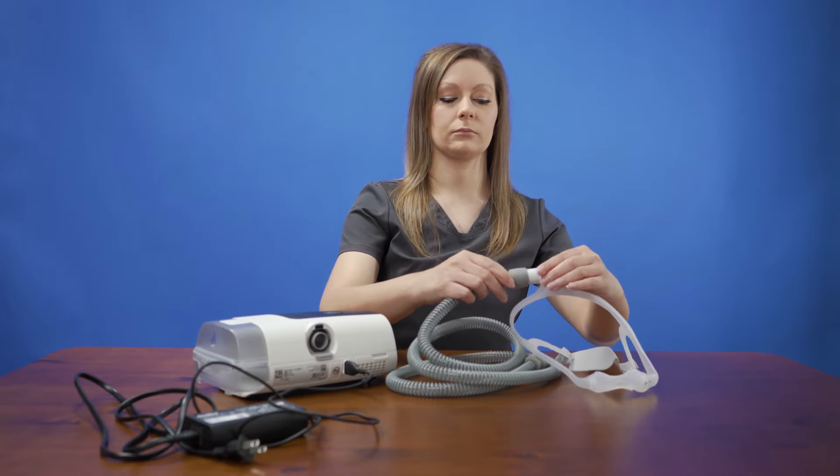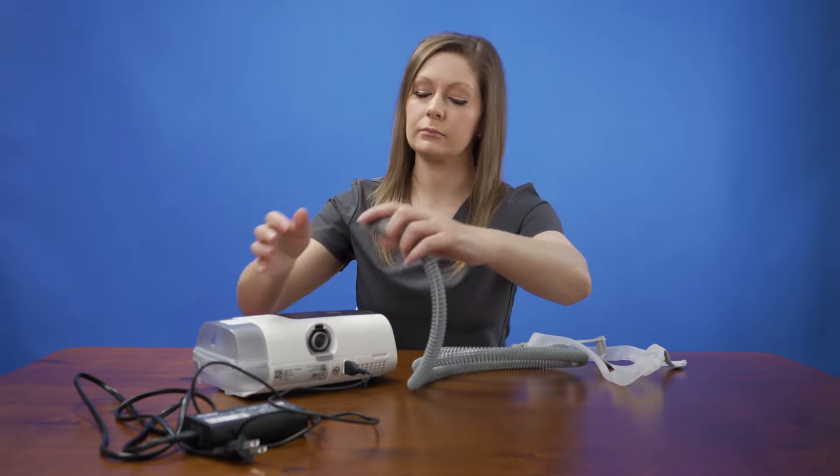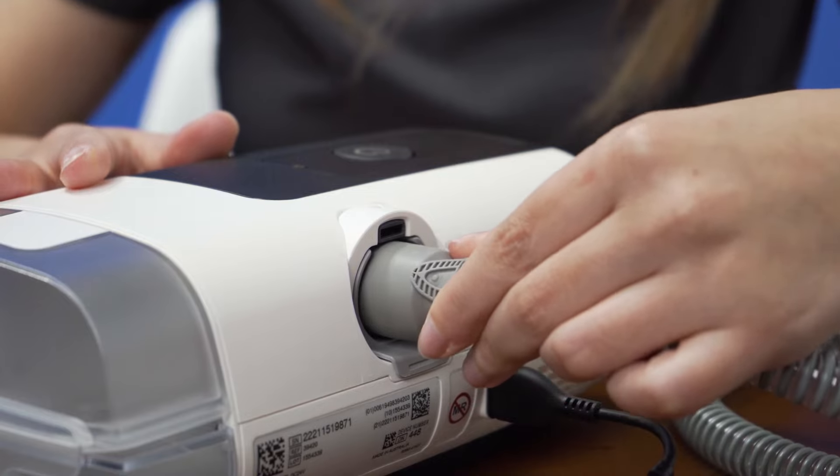Also on the back of the machine is where the tubing will connect. Take the tubing and connect one end to the assembled mask — both sides of the tubing are the same size. Connect the other end of the tubing to the air outlet of the device.